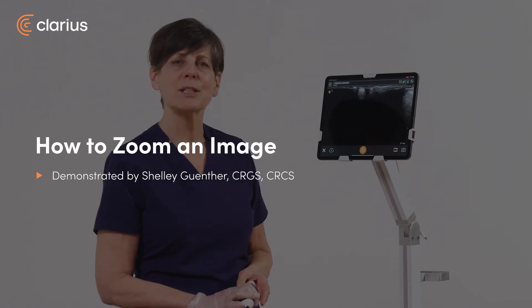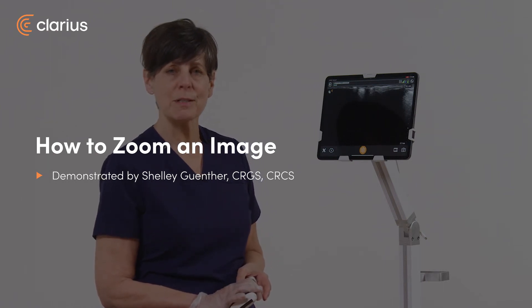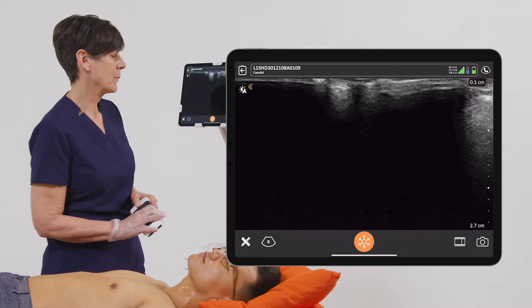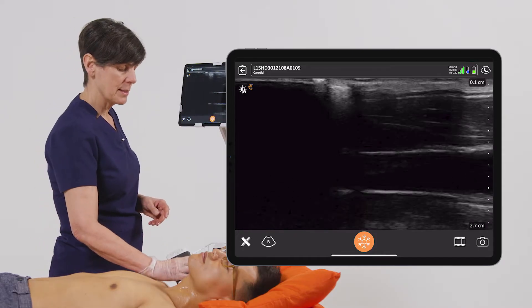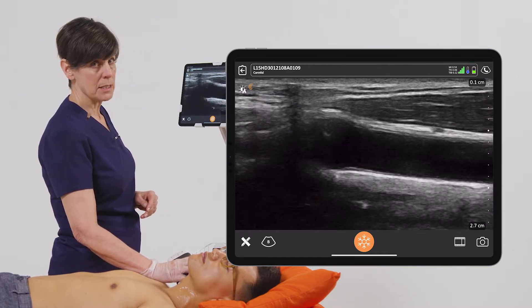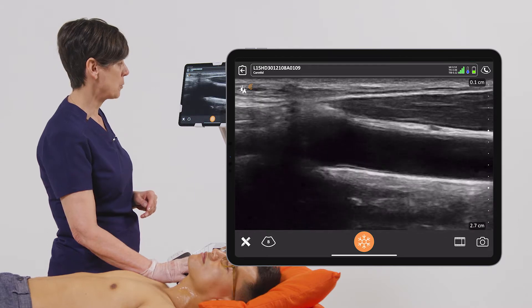Hi, I'm Shelly and today I'm going to show you how you can zoom your images or zoom structures within your images with your Clarius scanner. To do that I'm just going to scan the carotid artery and in particular I'm interested in the intimal lining along the posterior wall.